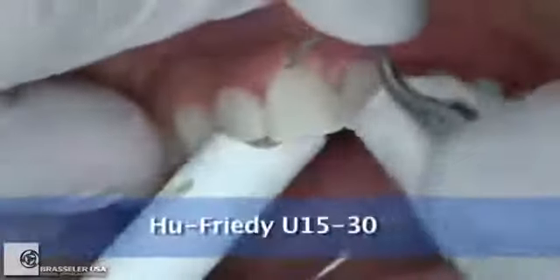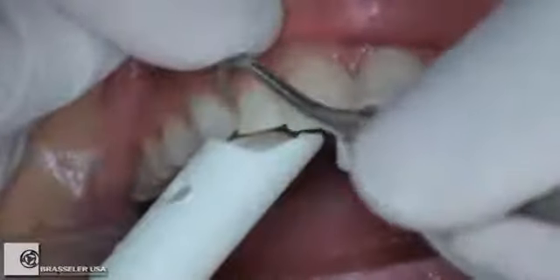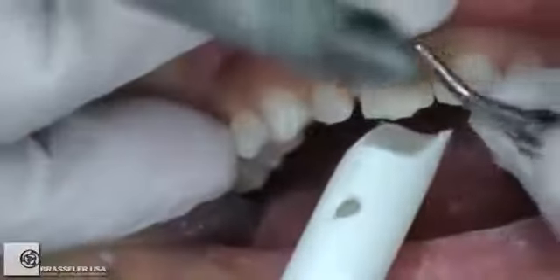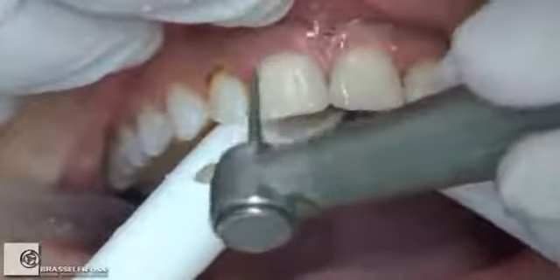All right, and we take that same burr and we do our gross reduction here to our depth cuts. And what you'll see very quickly here is that we haven't even prepped all the way through the composite. With older techniques, we would have just arbitrarily cut into the teeth and probably end up removing too much tooth structure. Now we're going to go ahead and just scale off the material, and your etch pattern was based on the time that this was going to be in the mouth. We talked about in the previous DVD. I just did a relatively small spot etch so that I can quickly pop off the rest of the material here. And you can see that we have really done very little tooth structure removal, if any.